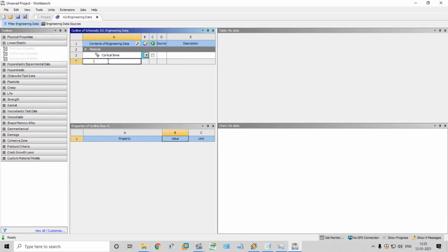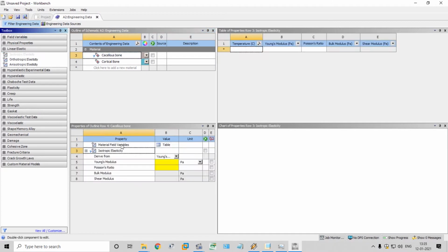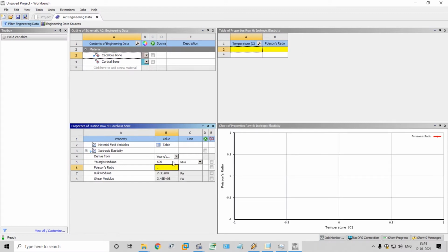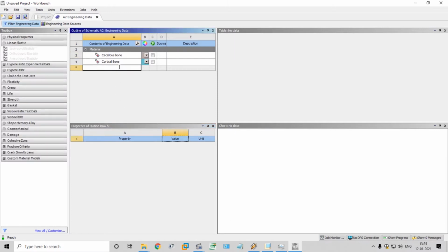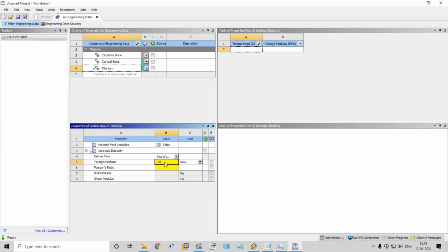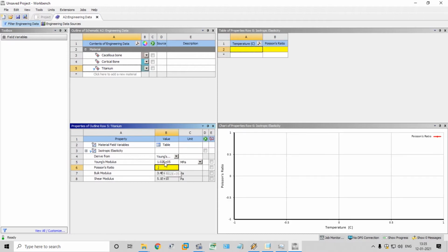Okay, next is the cancellous bone. Same isotropic elasticity, change it to megapascal, 690. You can see this in the journals. Okay, 0.3, same. Then titanium alloy, isotropic elasticity, megapascal change, and 102,000 megapascal, 0.4 Poisson's ratio.